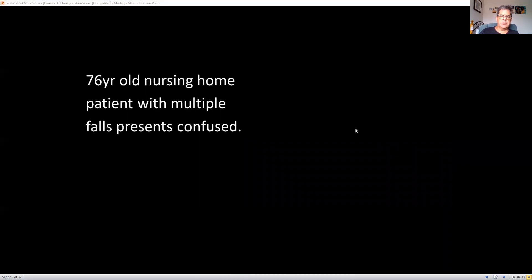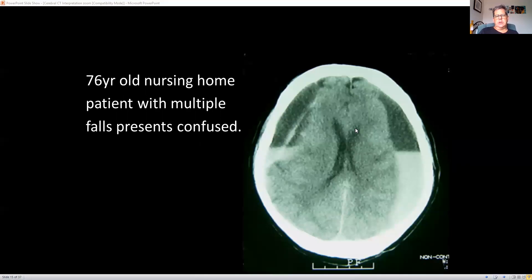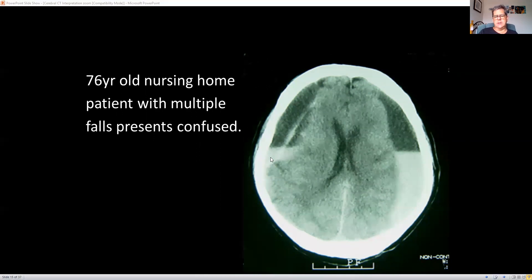A 76-year-old nursing home patient with multiple falls presents confused. This CT shows a chronic subdural on one side, and in fact there's one on the other side too. There's also an acute subdural at the bottom — they've been lying flat in the CT and the heavier blood has dropped down, forming a layering effect. Their brain is actually sitting squished in the middle. Because it's on both sides, you don't get much effacement of the lateral ventricles since they're both squished equally.